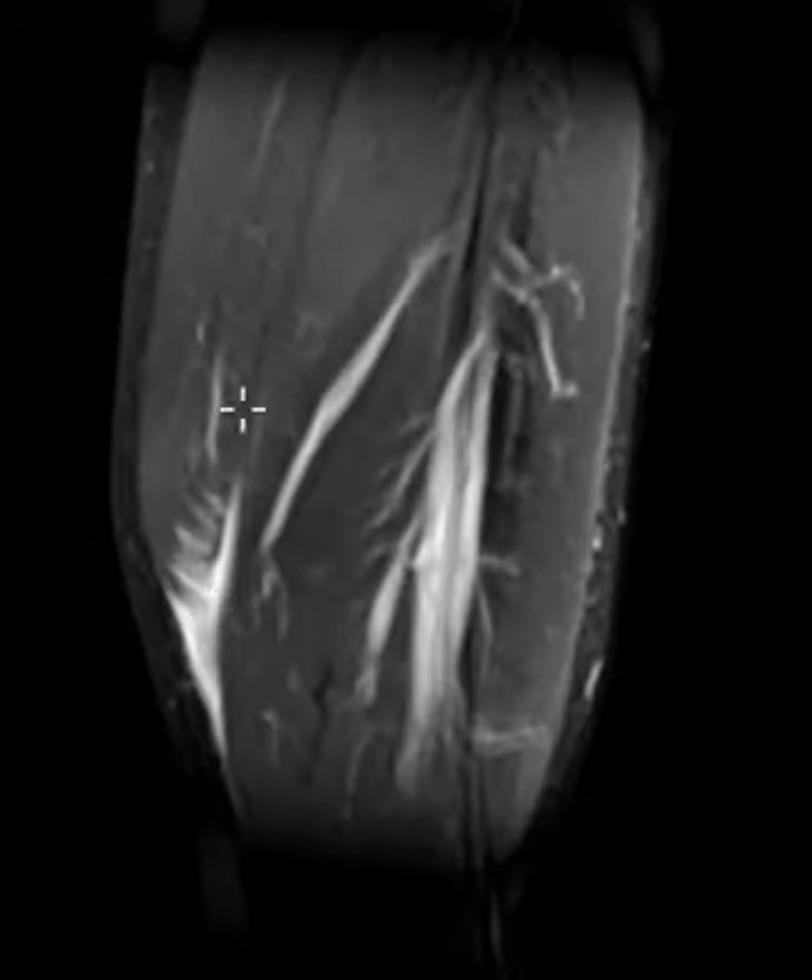So this is an example of tennis leg, which again is tearing of the gastrocnemius, and sometimes the soleus muscles here distally. Usually happens in the medial gastrocnemius, and it gets peeled up just like this. This is a really classic case, and a fairly common injury.